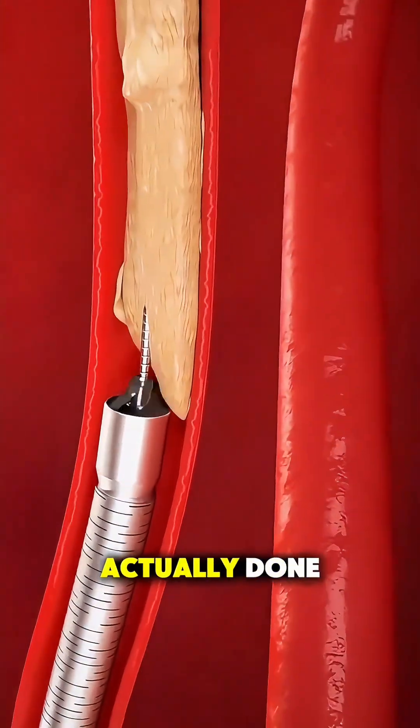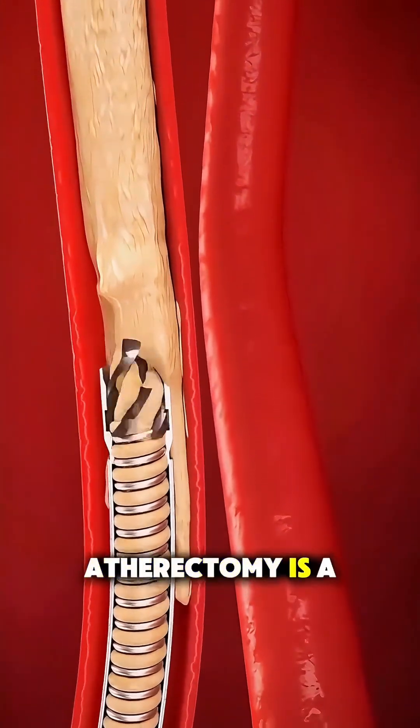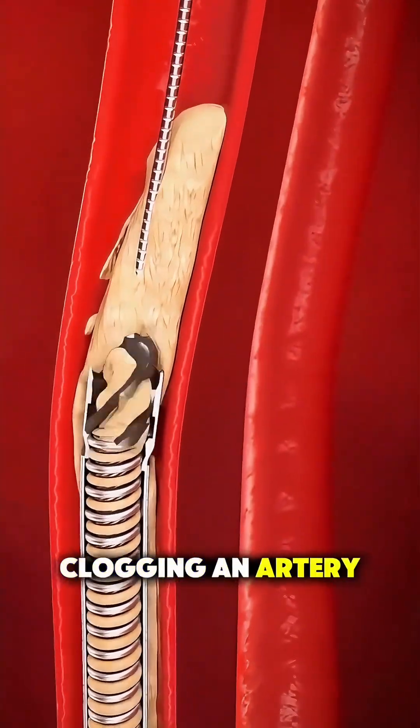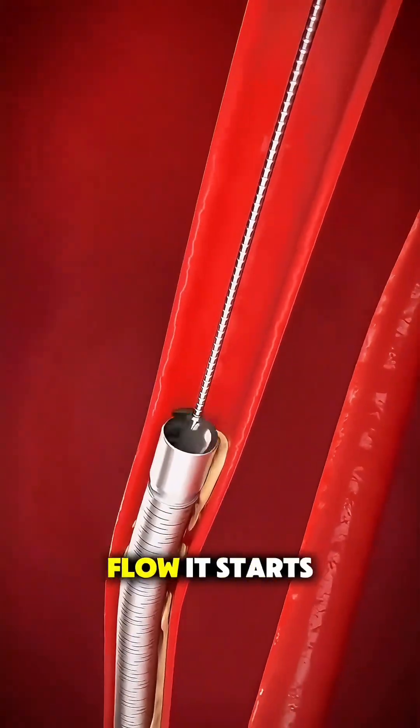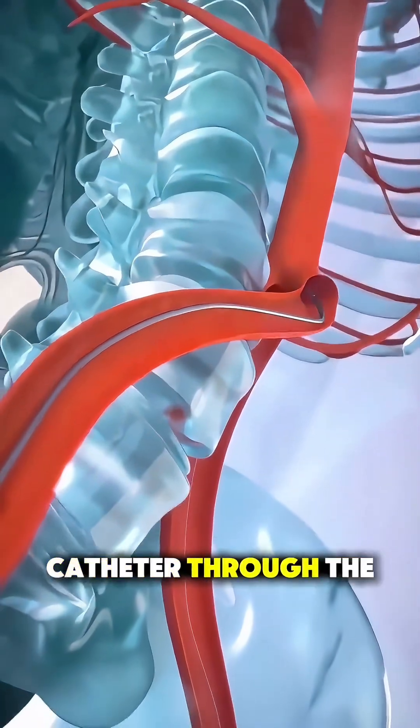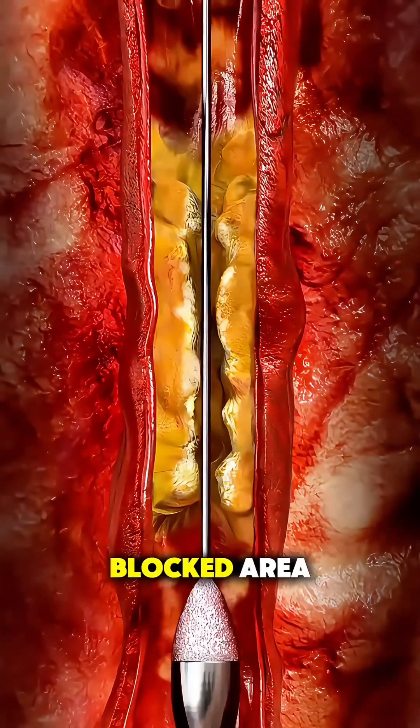Ever wonder how an atherectomy is actually done? Atherectomy is a minimally invasive procedure used to clear out plaque that's clogging an artery and blocking blood flow. It starts with a cardiology or vascular team guiding a tiny catheter through the blood vessels to reach the blocked area.